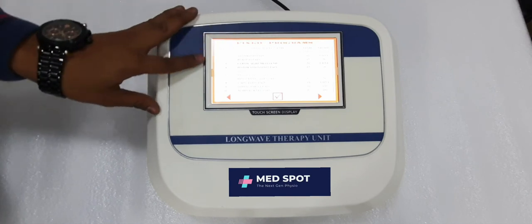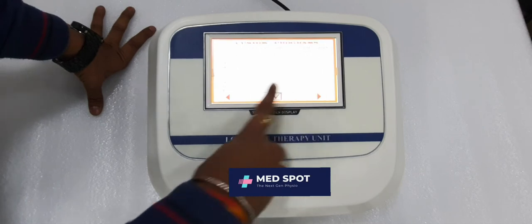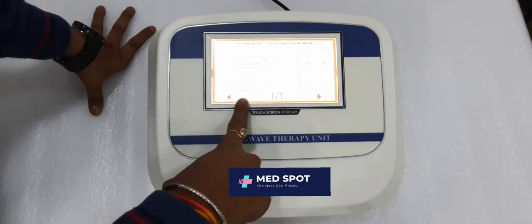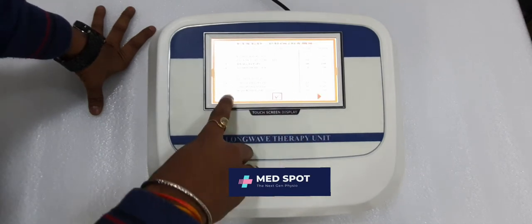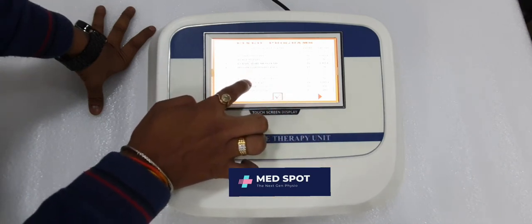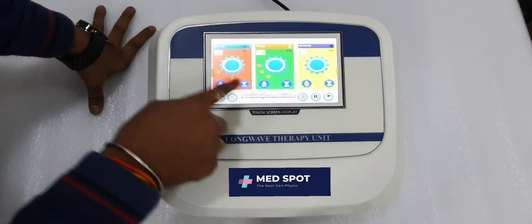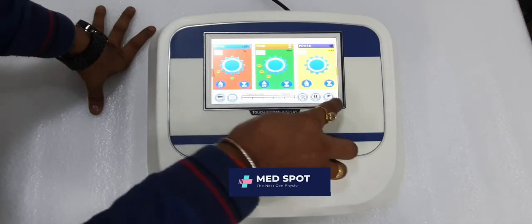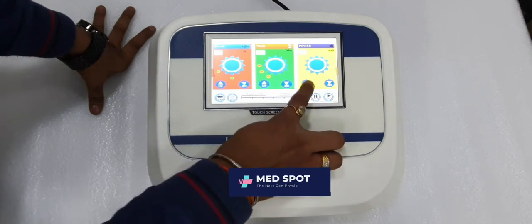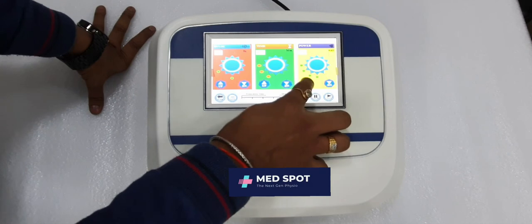Now for program mode, press this button. You can see there are 20 programs. Select any one program — for example, finger ligament disorder. The parameters are already set. Just start the machine again and raise or decrease the intensity — a very simple method.